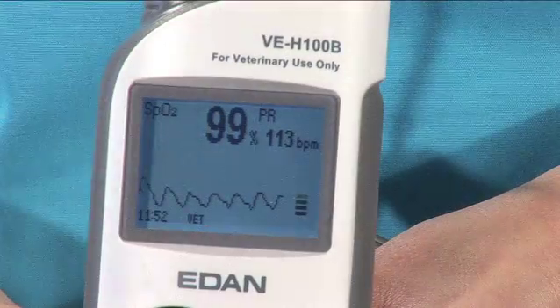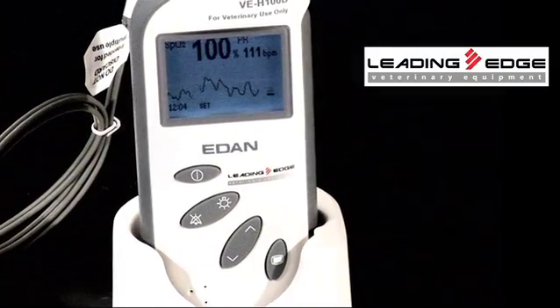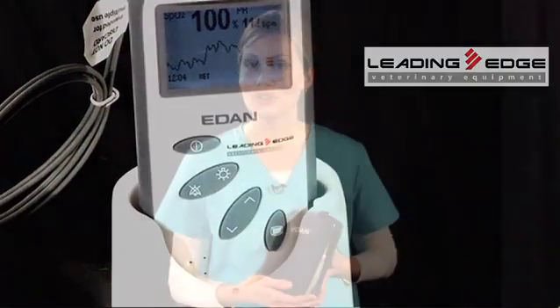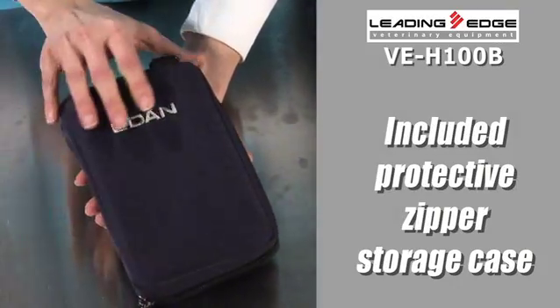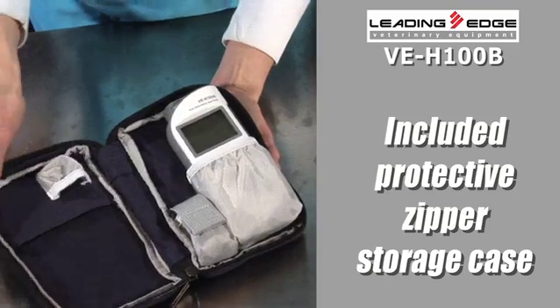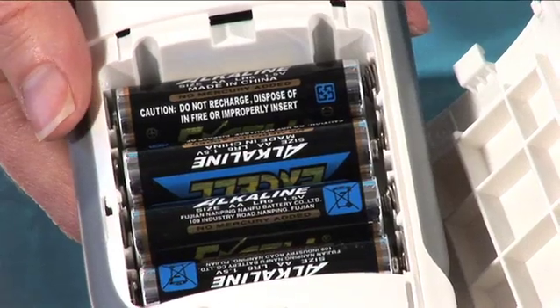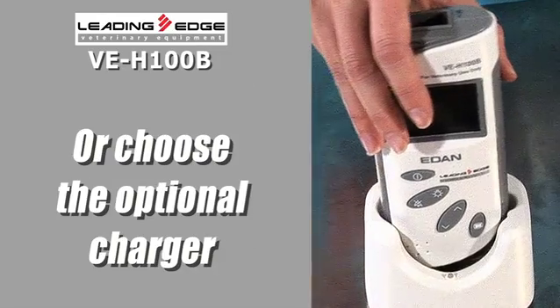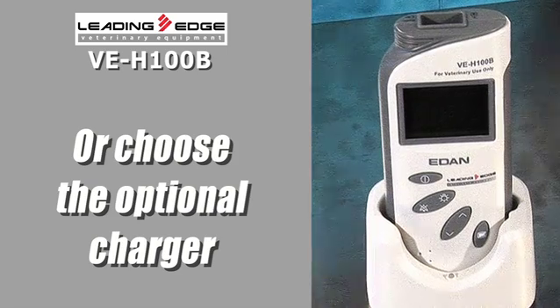The VEH-100B lets you monitor literally everything from a low-perfusion newborn kitten to a Clydesdale, at a dollar-friendly price. If you're on the go, you'll love the included zippered storage case, with no need to constantly worry about plugging it in or recharging. It boasts a 48-hour battery life from four AA batteries or the optional rechargeable battery pack, plus an auto shut-off feature to extend battery life.